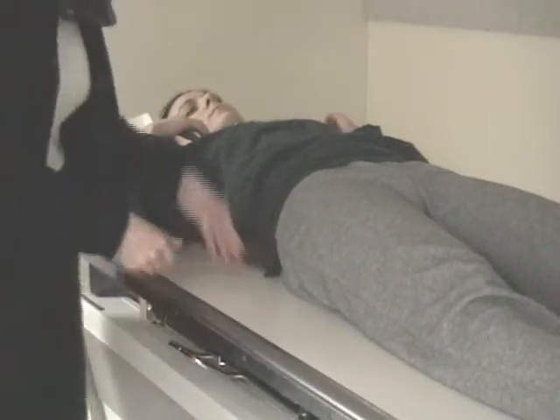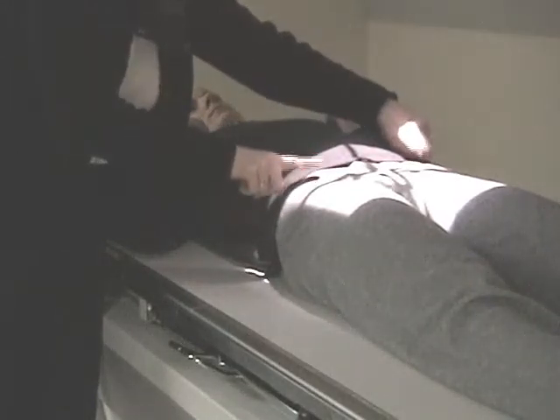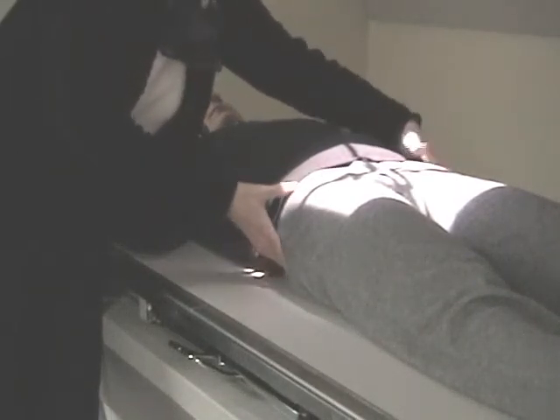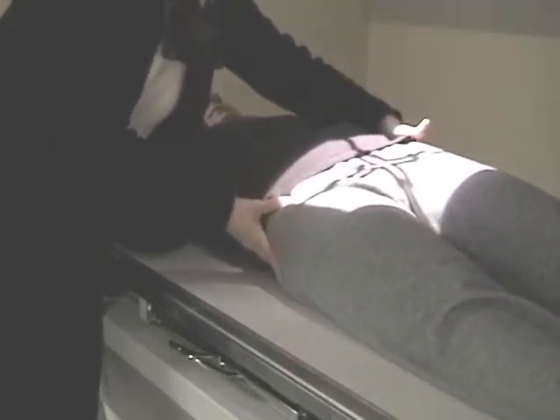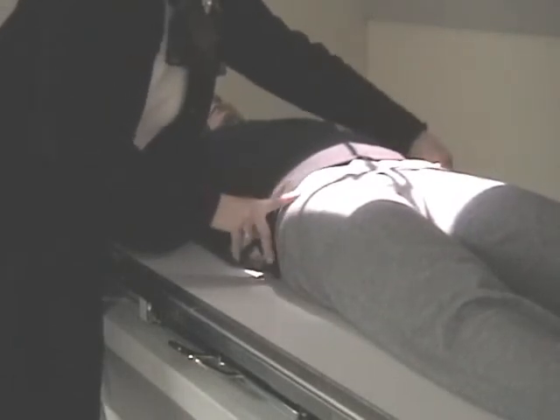Make sure she's not rotated. Make sure she's not tipped. You want to look at the ASIS and make sure they're the same height from the table. This would be rotated. You don't want that. Or this would be rotated. Don't want that. You want that pelvis, so the ASISs are the equal distance from the tabletop.